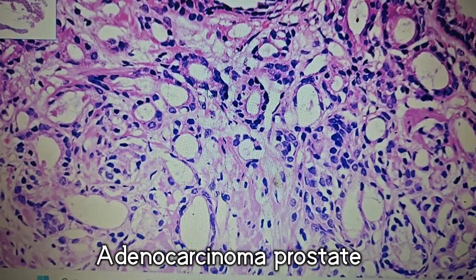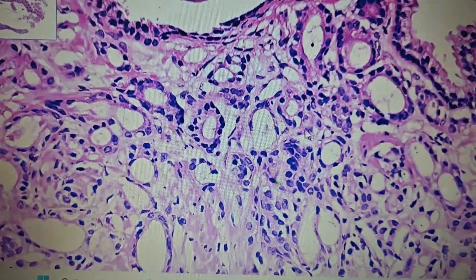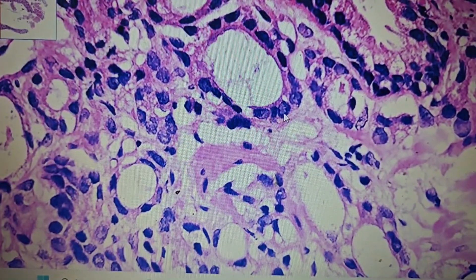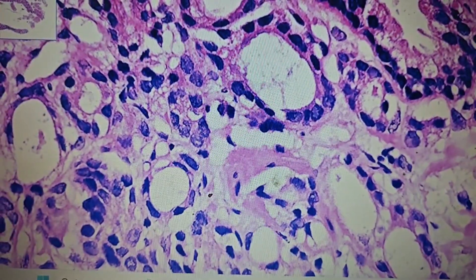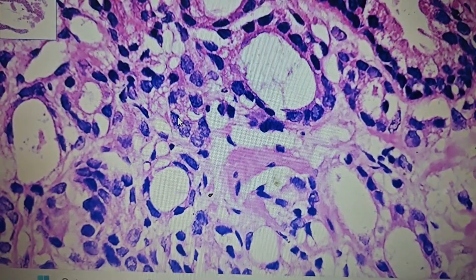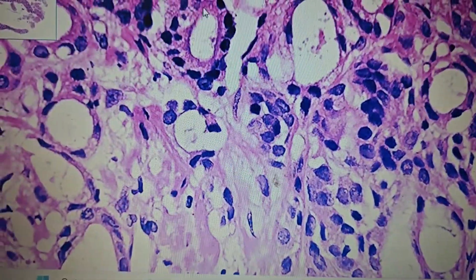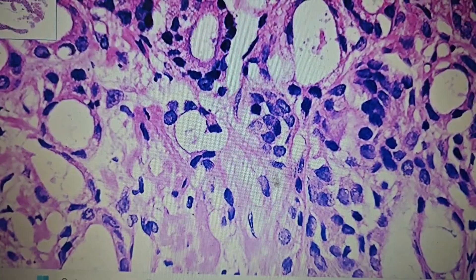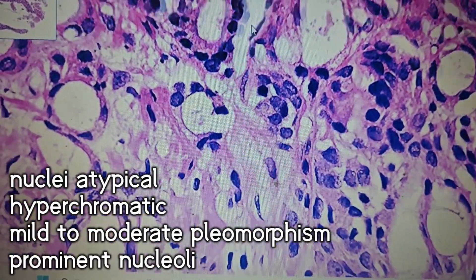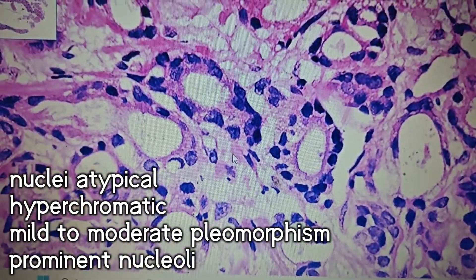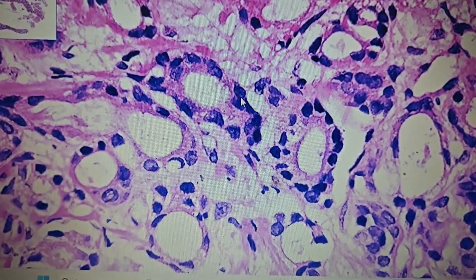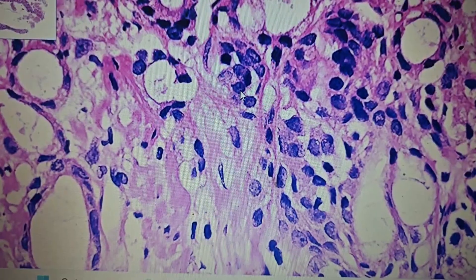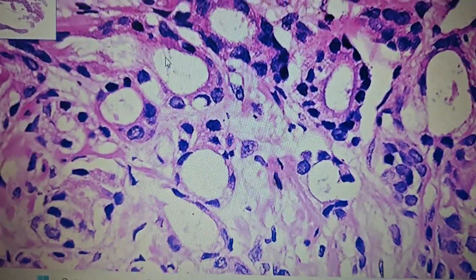Importantly, these glands are lined by a single-layered epithelium — the outer basal layer is lost. This is the characteristic feature of a malignant gland of the prostate. At higher power, you can see this is a gland with a single-layered epithelial lining and the surrounding stroma. The nuclei of these glands show hyperchomatism and mild to moderate pleomorphism, and at some points you can see prominent nucleoli in these cells.